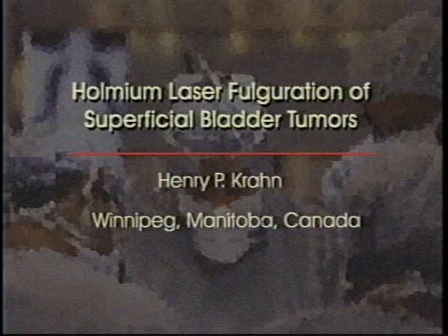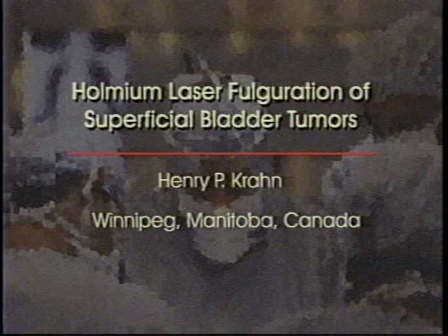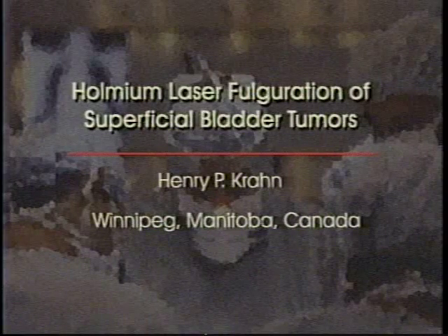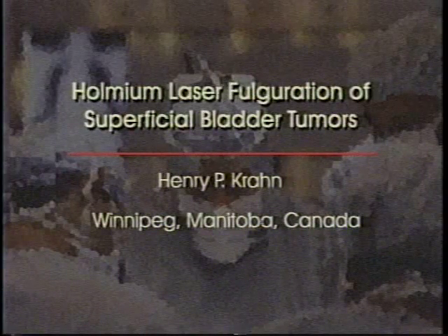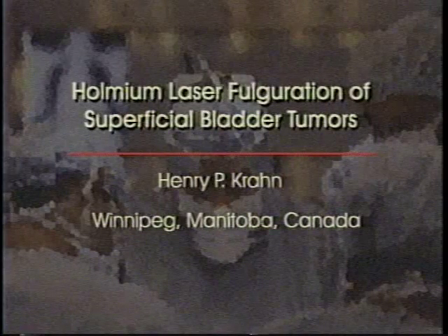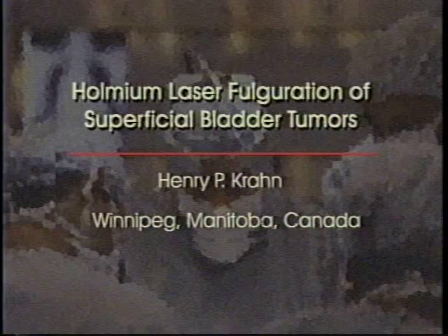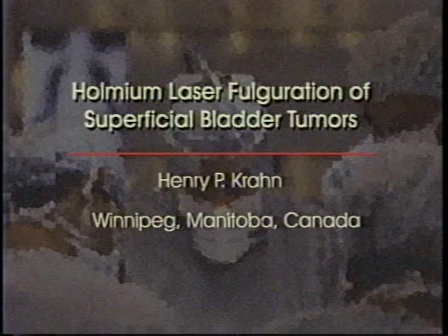The standard surgical treatment of superficial bladder tumors has been electrocautery fulguration using either a loop electrode or a roller ball. The disadvantage of this method of treatment is that the depth of the fulguration can be difficult to control, especially when the patient experiences bladder spasms due to stimulation of the obturator nerves.